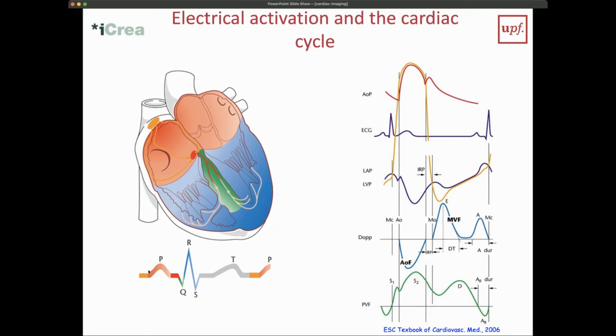Now, the ECG, as I said before: physiologically, the activation starts from the sinus node, and that is shown on your ECG as the P wave, as we say. So this little P wave is the physiological onset of a cardiac cycle. The P wave shows you the electrical activation of the atria, and then you have a little break, and then the activation of the ventricle starts, after it goes through the AV node.